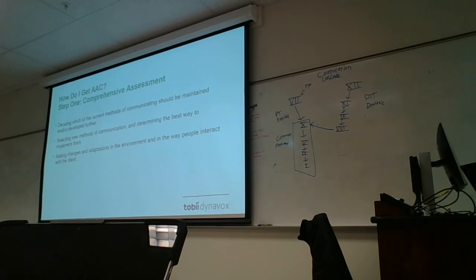Once the device is decided, we talk about the communication software, and if there are any access methods, that's also part of the conversation. The other crucial part is different mounting options. This device here, the i16, is on a tabletop mount. We also have floor stand mounts, so there's a base that looks like this.